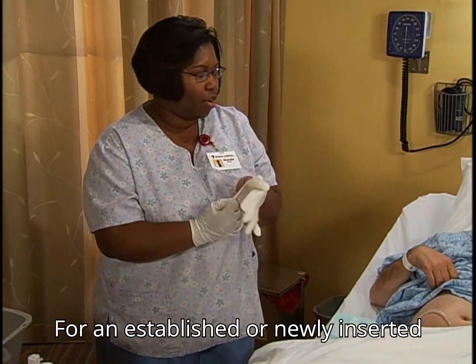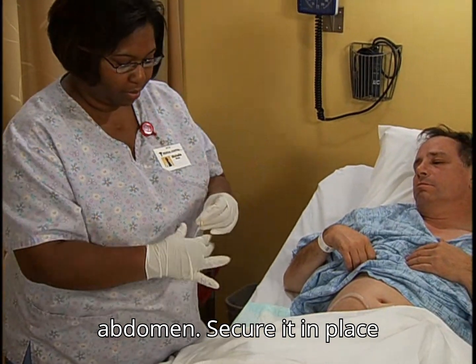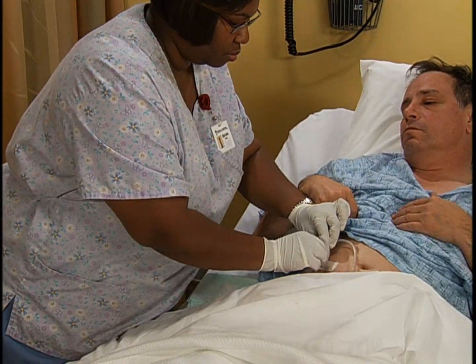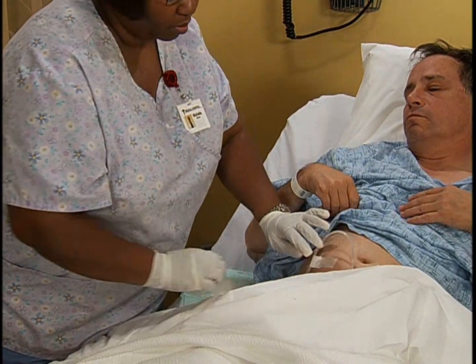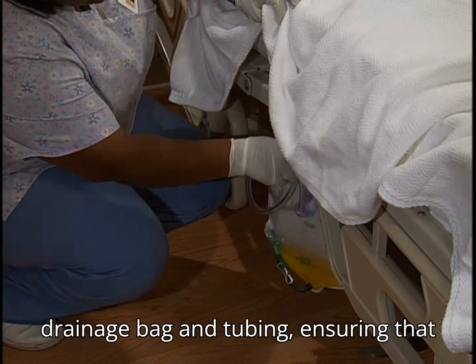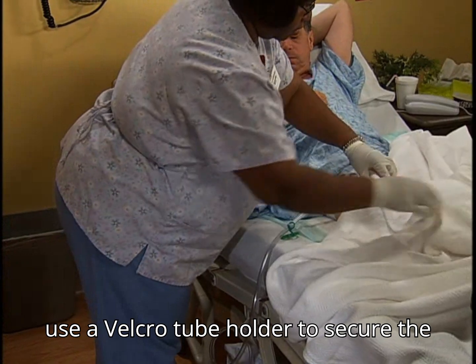For an established or newly inserted catheter, apply clean gloves and loop the catheter on the patient's abdomen. Secure it in place with tape to reduce tension on the insertion site, or use a multipurpose tube holder to secure. Next, check the placement of the urine drainage bag and tubing, ensuring that the bag is below the level of the bladder at all times. If needed, use a Velcro tube holder to secure the tubing.